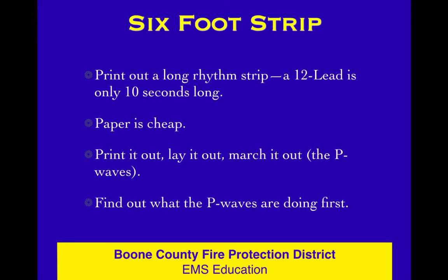I would really like to have a 6-foot strip, not a 6-second strip. A 12 lead's only 10 seconds long. When I'm trying to look at AV blocks, I don't need 12 leads. I need 12 foot of EKG paper. Your managers may freak out when I say this, but that's just EKG paper. That's pretty cheap. They'll buy some more.